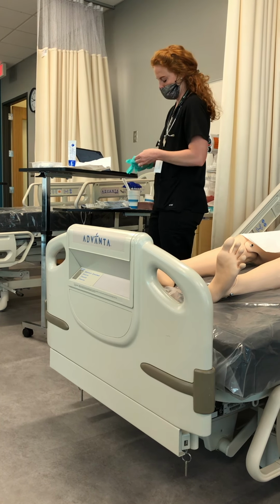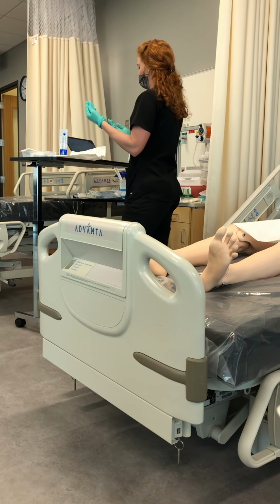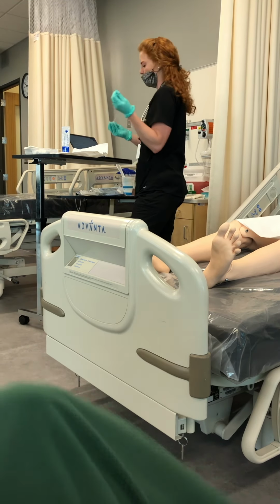With both hands sterile, pick up the suction catheter and wrap. So this one's a little bit shorter than some of the others. I have this one here as well. Oh, maybe they're all that short. That's odd. For some reason, I feel like last year we were really wrapping around. Anyway, so yeah, about 40 centimeters, give or take.